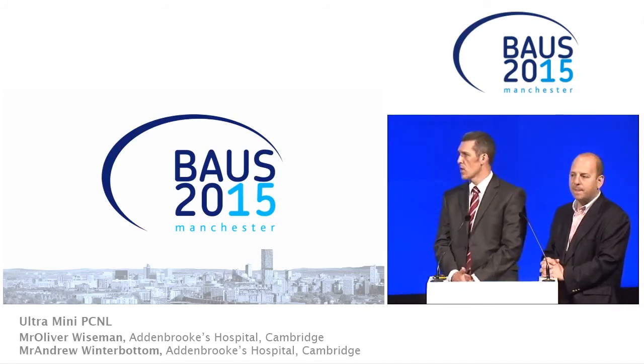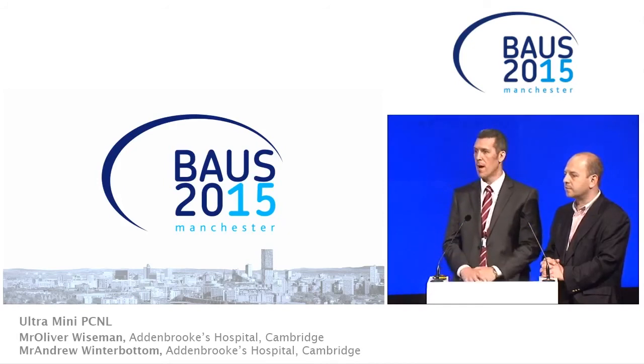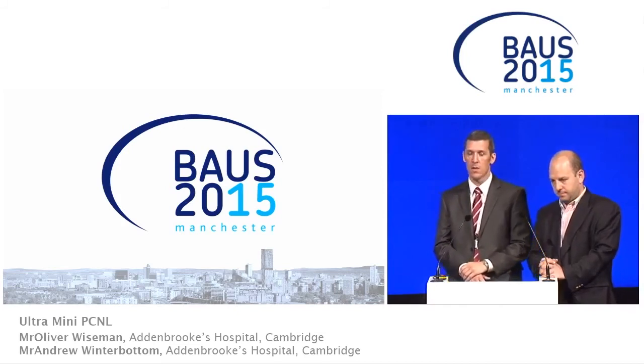I mean, as a radiologist, I primarily use ultrasound. I make a point of looking for the bowel. Always look at the bowel. I always show the urologist the bowel on the way in just to show them how close it is. You can see it, you can identify it, you can avoid it. Always look for pleura as well. So I always use ultrasound.